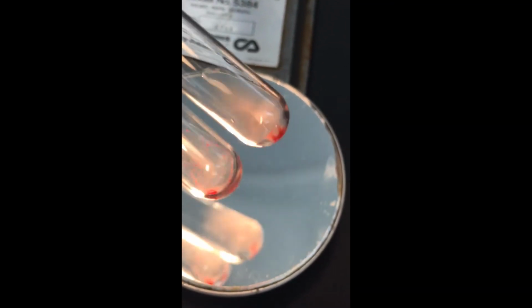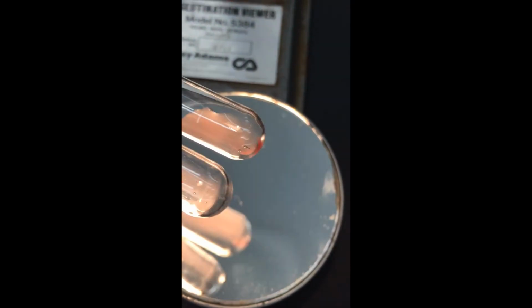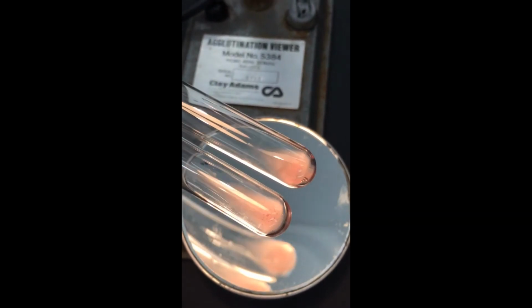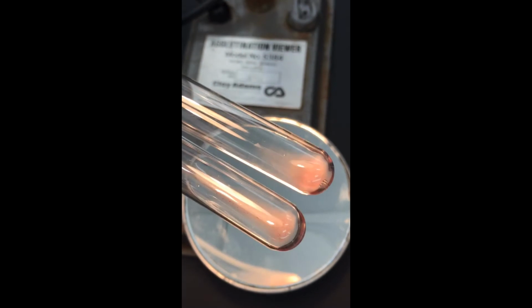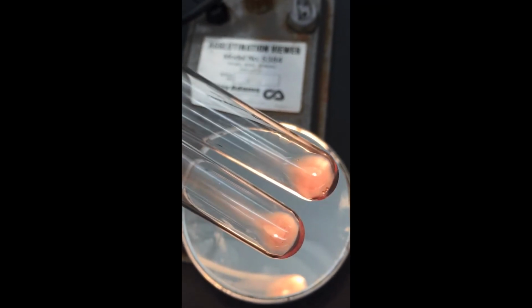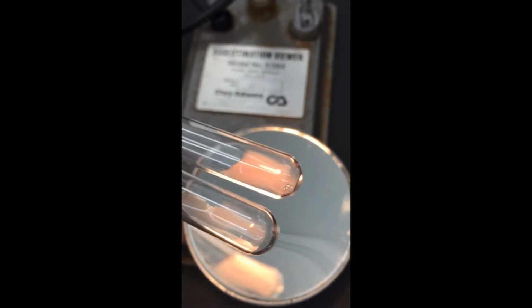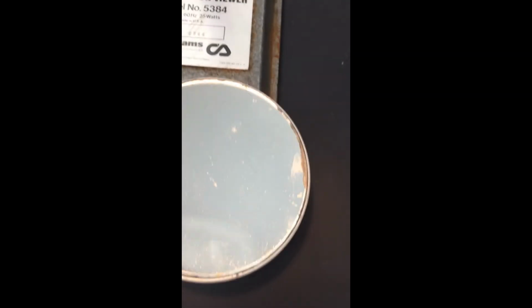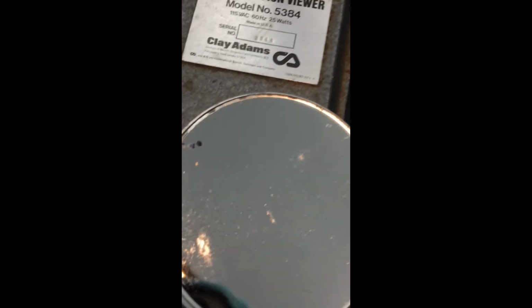This is sample C. This is after 37 degrees, washing and adding AHG. Okay, try to get this where you can see, especially cell 1, which is at the bottom. Cell 2 is the top or the right. Cell 3 and 4.